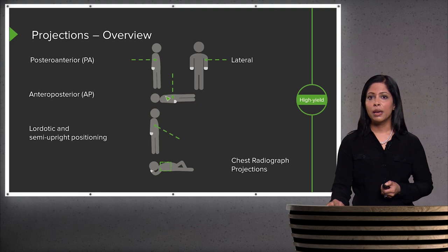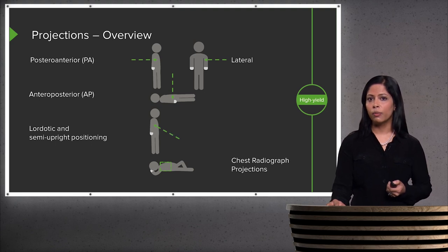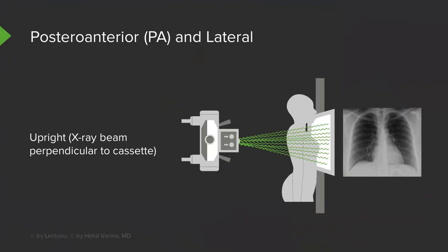This is an example of an AP, or anteroposterior, view which is occasionally obtained particularly in patients that aren't able to stand upright. This is an example of a lordotic or semi-upright position, which we'll discuss further. The standard PA and lateral is the view most commonly encountered when the patient has a normal chest x-ray.